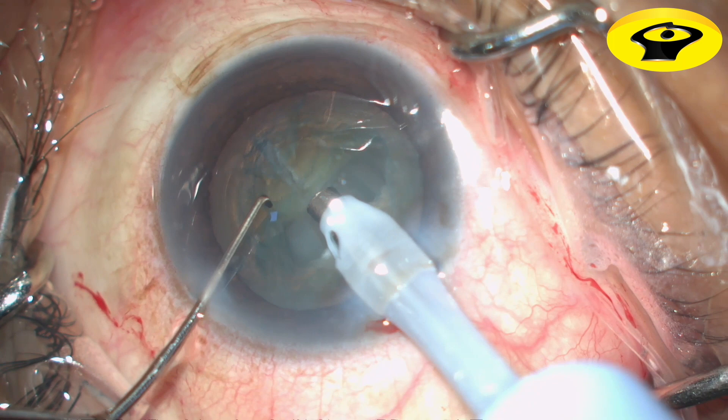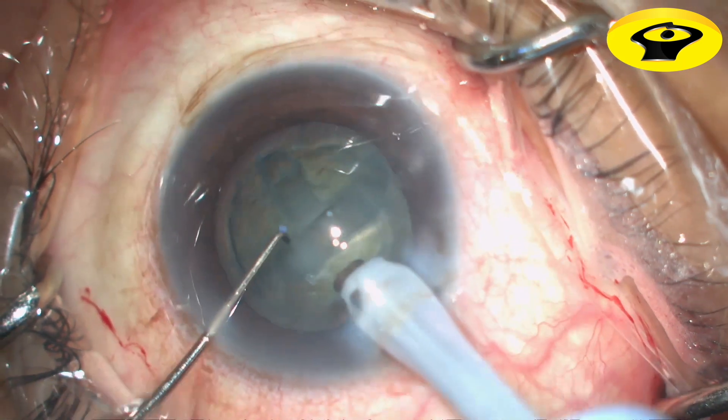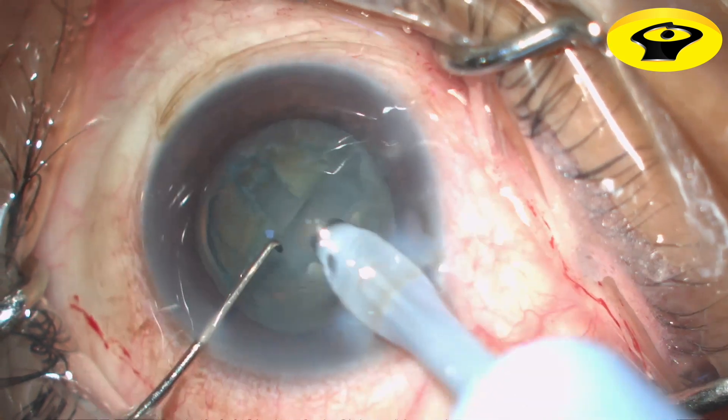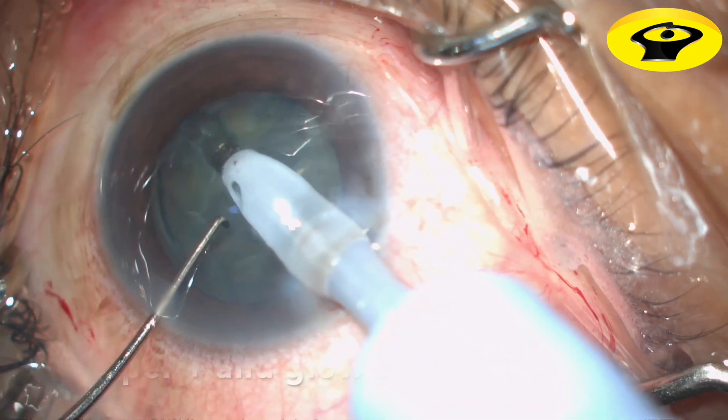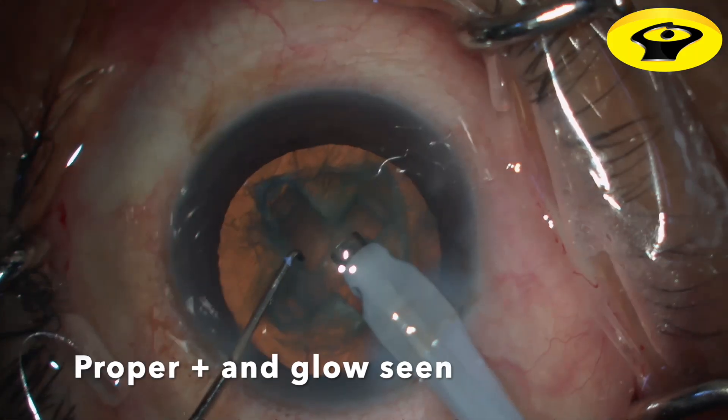In this case, the 180-degree groove is sculpted first and the perpendicular one is completed later to create a cross pattern. Make sure that the glow is seen posteriorly at the base of the nucleus.